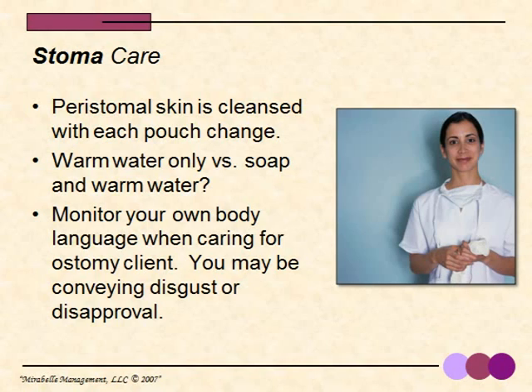WOC nurses, these are wound and ostomy care nurses, often say not to use any soap as many do leave a residue, and that inhibits the pouch from adhering to the skin, which is necessary for a tight seal. Examples of soaps containing moisturizers and oils would be cream soaps, liquid wipes, and baby wipes. I suggest you follow the guidelines your nurse provides for your client requiring ostomy care.